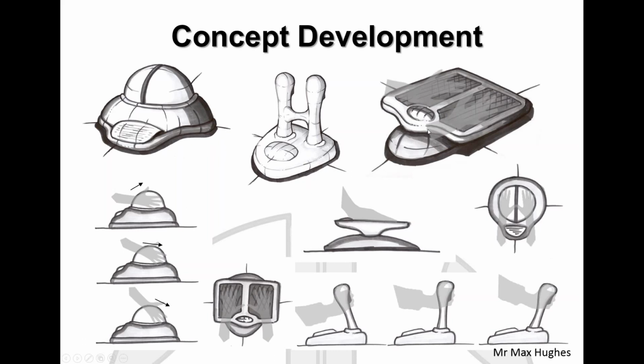This one here on the right requires you effectively just to put 2 hands on a slab or a flat square here, and then you move your hands backwards and forwards. This one here requires you to put your hands on top of this sphere or orb-shaped aspect of the controller. And effectively, all we're asking the person to do is move the controller forward, back, left or right. So it's just a rotation around the wrists. It's not requiring button presses.